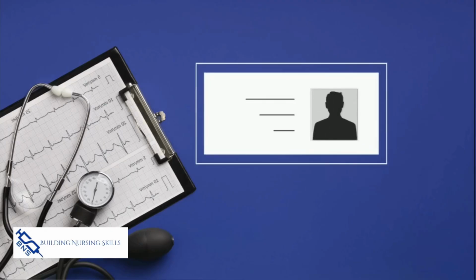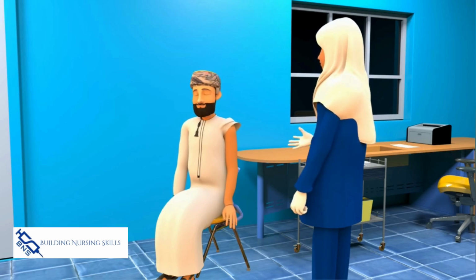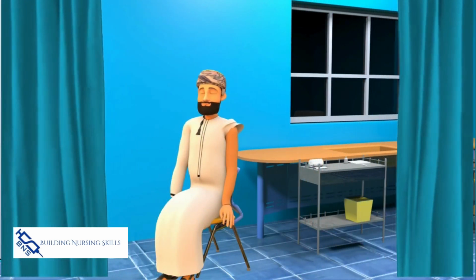Confirms the patient's identity using at least 2 patient identifiers. Checks ID and asks full name. Introduces self and explains the procedure to the patient. Provides privacy by closing the door to the patient's room and/or drawing the curtain surrounding the patient's bed.